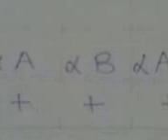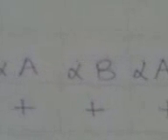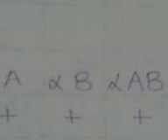In my case, I found agglutination in all three test tubes. This means both antigen A and antigen B are present. We have already discovered that the presence of antigen A and the presence of antigen B makes you blood type AB. That means my patient right here is blood type AB.